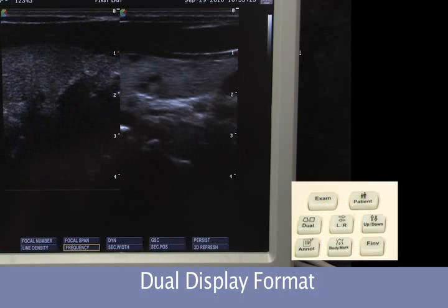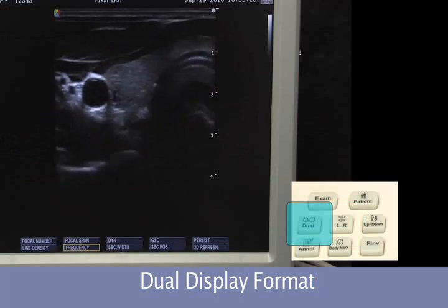Unfreeze the image, press the dual button again, and we return to single frame format.